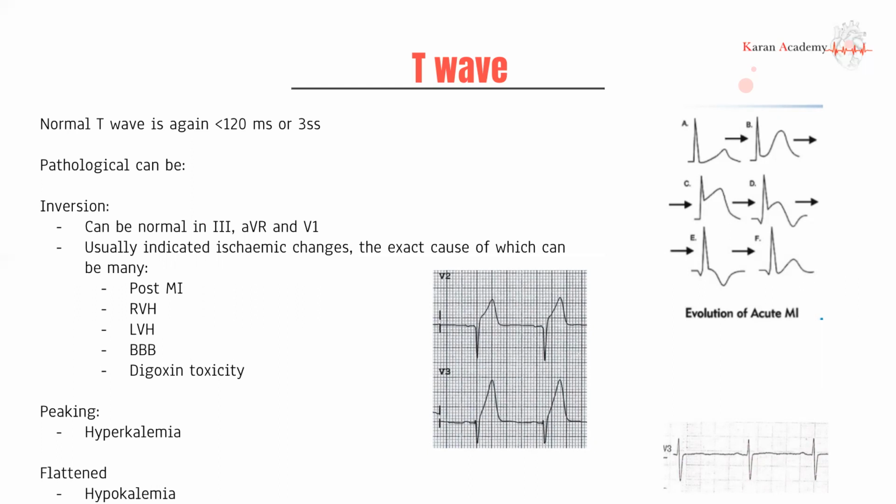So now you have much more muscle supplied by a little less blood. You're going to have something called a relative ischemia, where you still have blood flowing, you don't have an acute occlusion, but just because of the sheer size of the muscle, it's not getting oxygenated as much as it should, and therefore can present with T wave inversions.